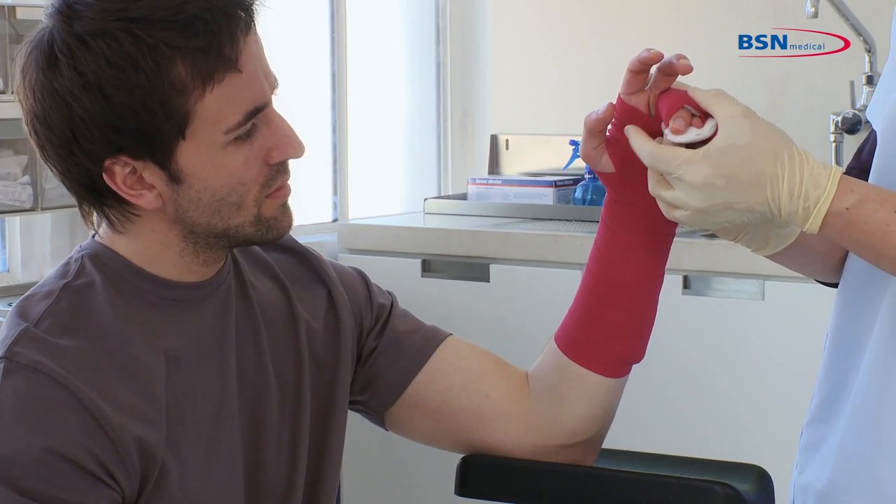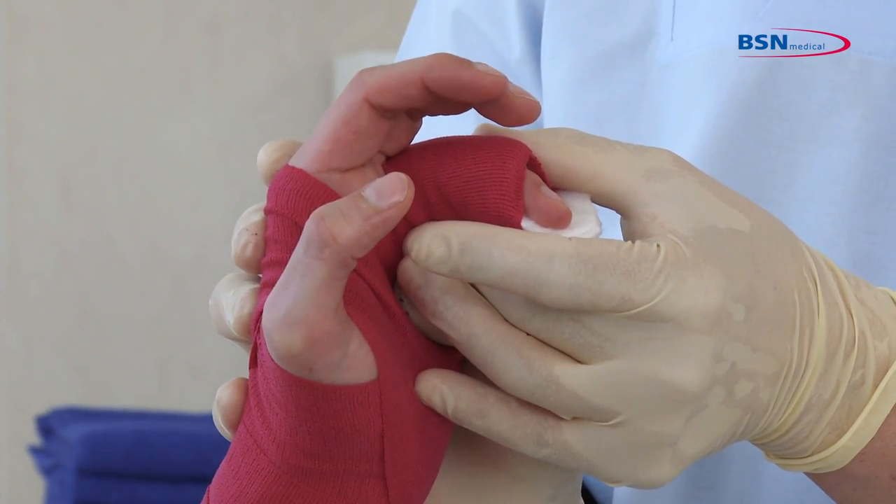Position until the splint is in a rigid position. Mould as prescribed by the physician.